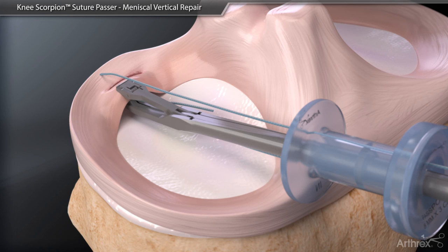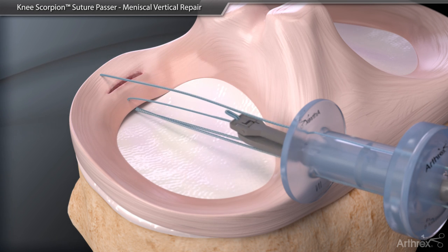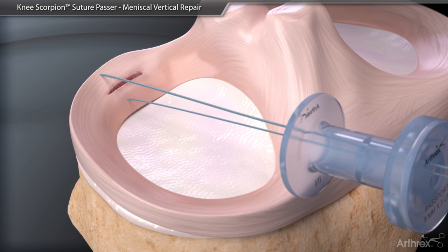Pass the loaded suture through the tissue anterior to the tear. Remove the suture from the Knee Scorpion. An arthroscopic knot of the surgeon's choice is completed.